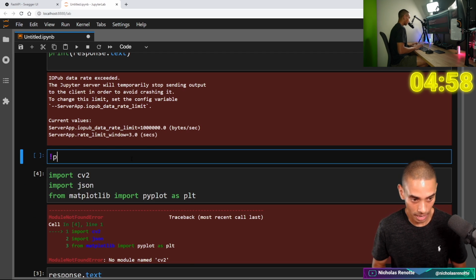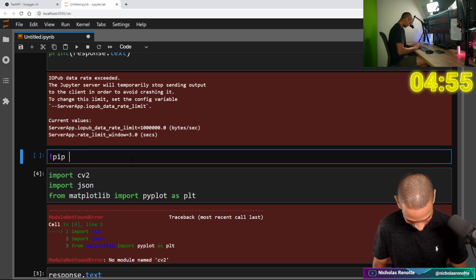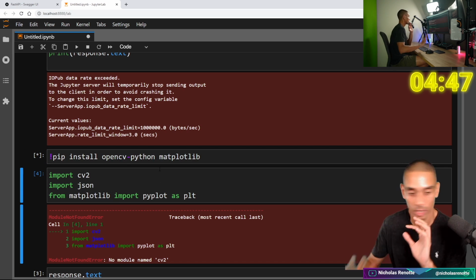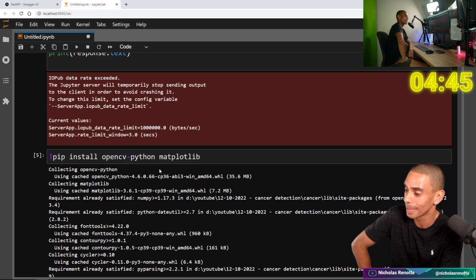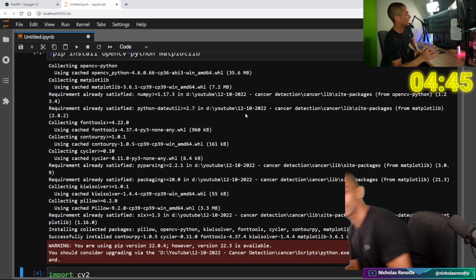Damn it. All right, so we are smashing this. We are going to have to install opencv-python and then matplotlib, I'm guessing as well. Let's pause it. 4:45. Oh man, I didn't anticipate having to install all this stuff. This is going to be cutting it close. All right, that is it. Installed. Beautiful. Let's go.